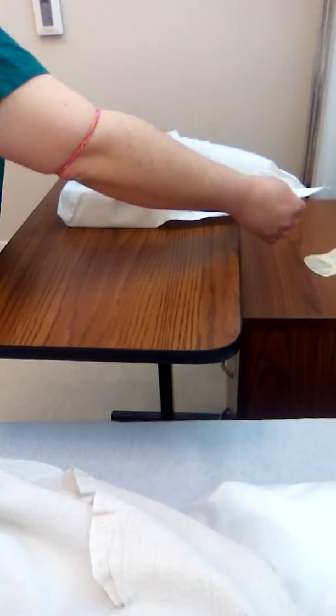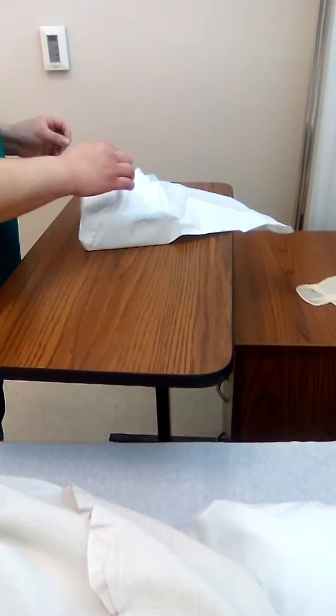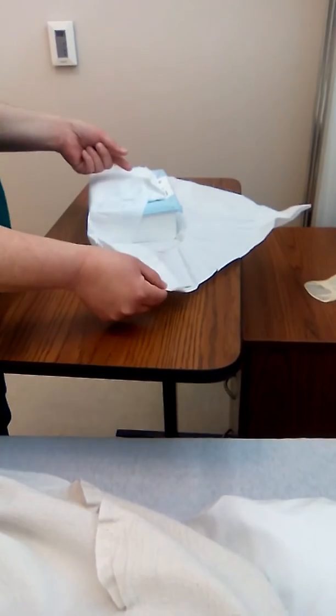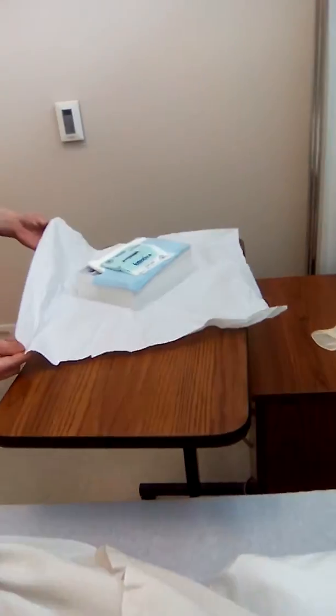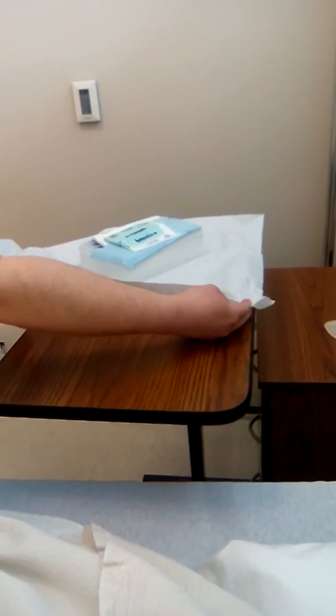So from here, I would gather all of my appropriate equipment that I needed for the right size and the right type of catheter. I'm going to arrange for help if I need to, and I'm going to explain the procedure to the patient that we're going to be inserting an indwelling catheter into their bladder today. So from here, I'm going to go ahead and I will perform hand hygiene. I'm going to make sure the patient is comfortable. I'm going to provide privacy for the patient.